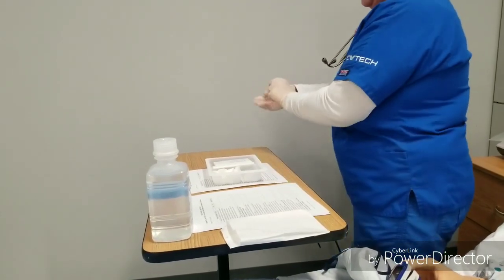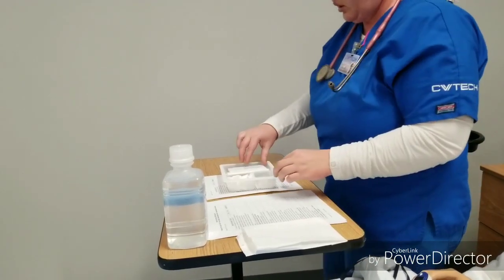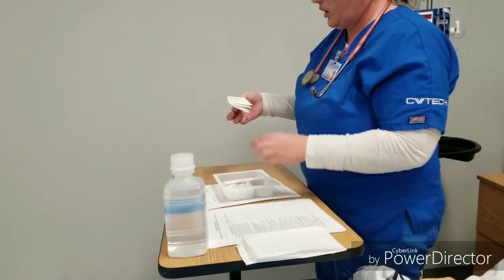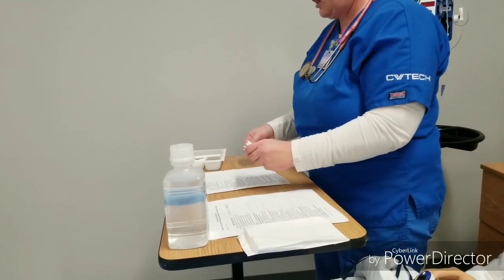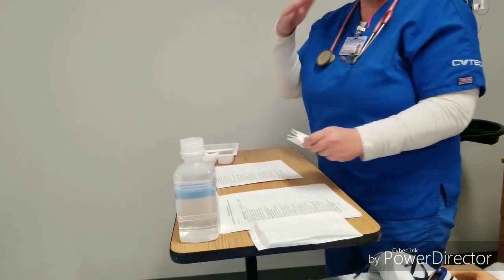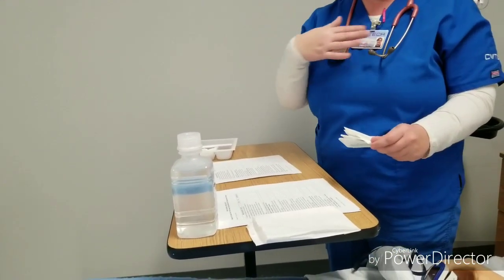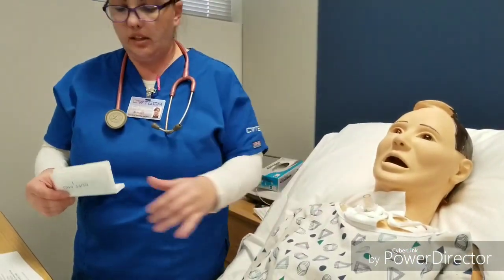Discard this. I will take these off. So there's gloves in here. Take my gloves out. Move this. Remember, everything in there is sterile. It comes with a drape that we're going to put on the patient to keep the patient's chest dry and everything. And we're going to change this dressing underneath the trach.